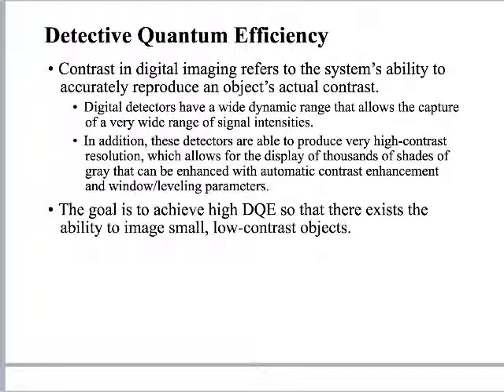We can improve efficiency and electrical power usage. There's a lot of economic reasons we'd want to do that, right? Plus patient care reasons. So we're trying to increase the DQE, increase the detective quantum efficiency. And then we want to improve this low contrast resolution.